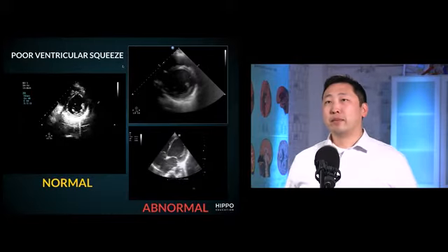Yeah, I use it a lot in shortness of breath patients or chest pain patients, just to look and be like, okay, am I thinking about ACS, PE, CHF, just COPD? Stratifying the differences between those gives you an idea of how that works, and it just makes it a lot easier in terms of making diagnoses.